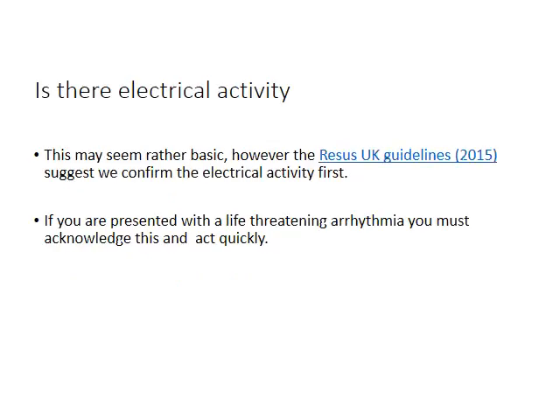Is there electrical activity? Now this seems rather obvious, however the Resus UK 2015 guidelines suggest that we start with this, and clinical situations will dictate the urgency of this assessment. If you're not familiar with the Resus guidelines, then take time to have a look. There's a hyperlink available, or go to the Resus Council UK website.